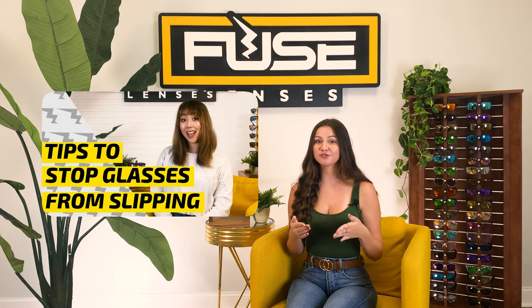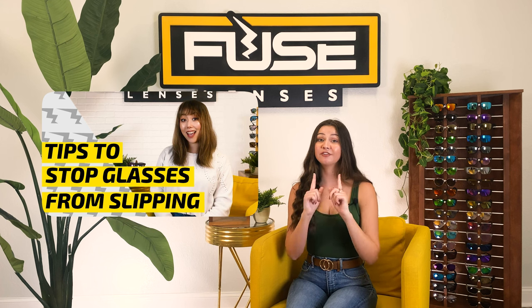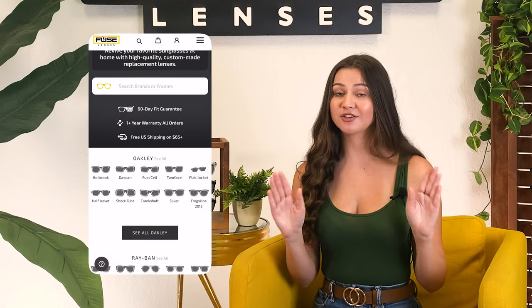In our video on how to keep glasses from sliding down your nose, we cover techniques like how to adjust the arms, fix the screws, and how to use nose pads, ear grips, and wax to adjust the fit of your frames. But say you've cleaned your lenses with your shirt one too many times and just don't know what to do — Fuse Lenses can help you with lens replacements and new shades. You can find replacement lenses for any brand on our website.